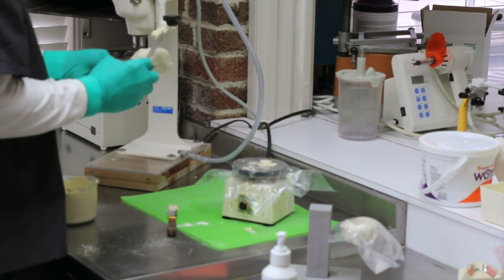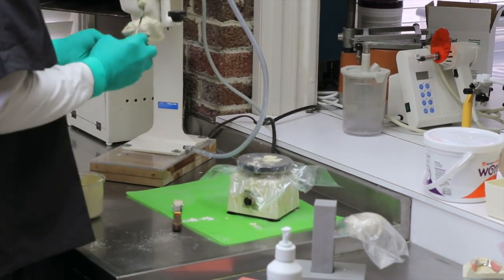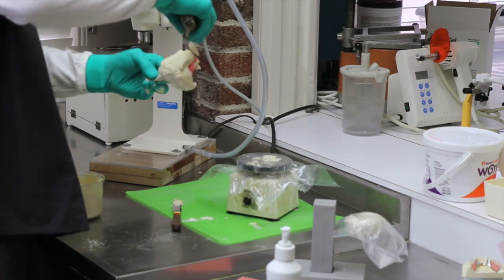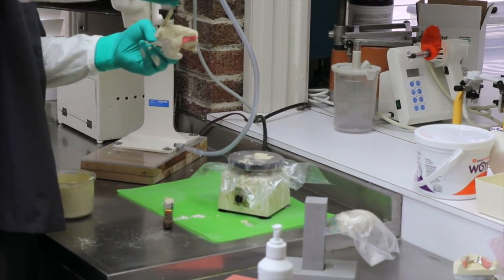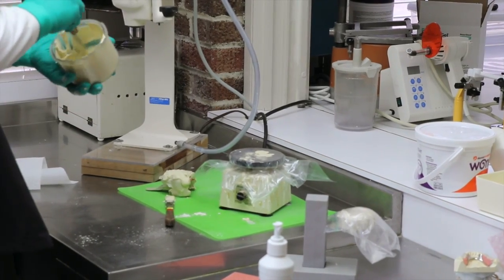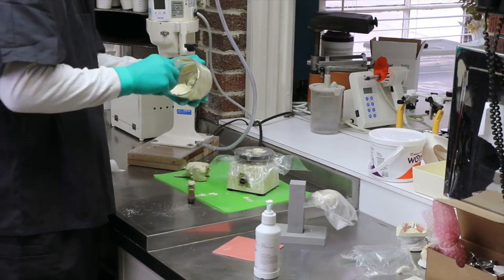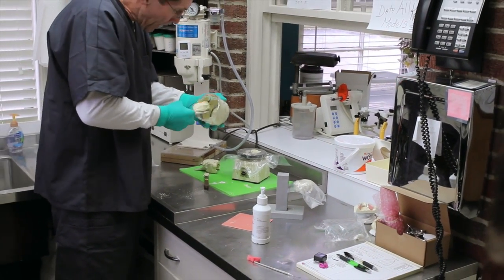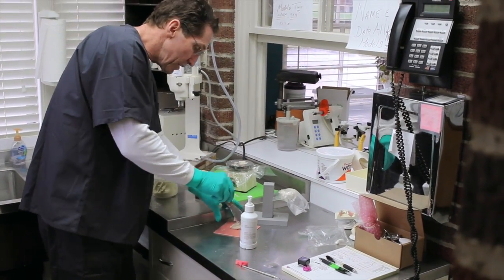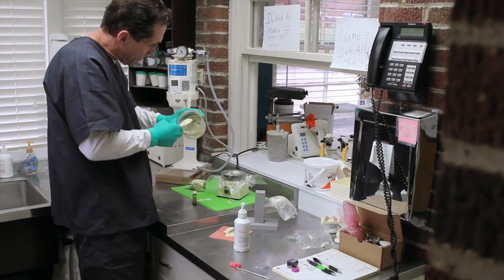And then again, nice thing with this, with the Wonder Fill, the tongue space, it really makes pouring this so very much easier. We'll get that roughly filled there. Now, contrary to what some individuals say, they say you should never invert an impression. Well, I can tell you I've inverted impressions for 35 years, and I've never had a problem or any kind of distortion as a result of it. Again, you can do as you like. I'm just sharing with you what I personally do.